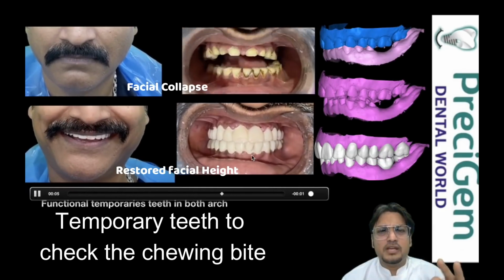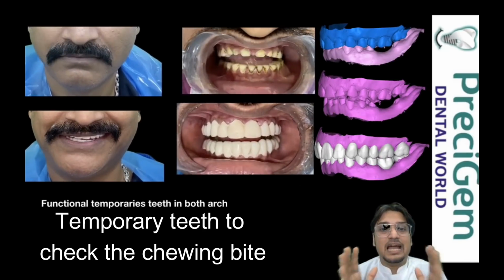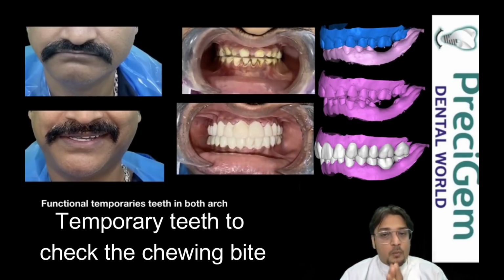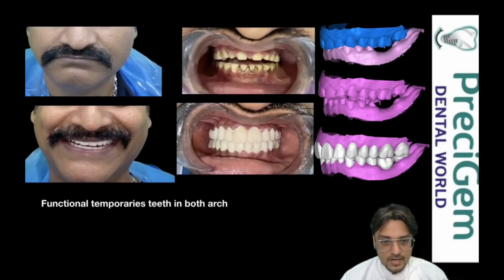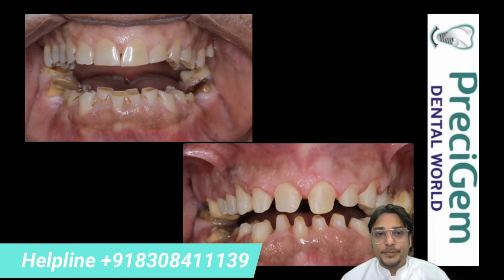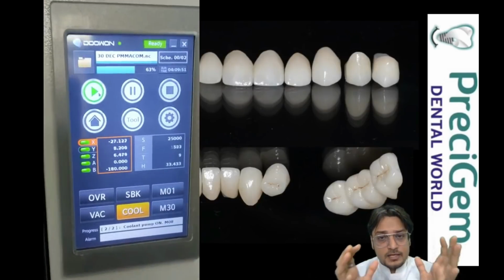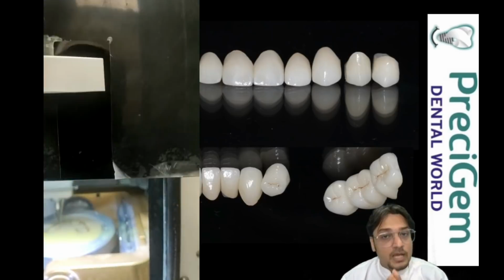Now this is a temporary. This is given to the patient until he gets adjusted to the new teeth. Once this temporary is properly adjusted, what is done is we do a proper preparation of the teeth so that you can receive new teeth on this. After this proper preparation, in the computer, the files are given to the CAD CAM milling machine.